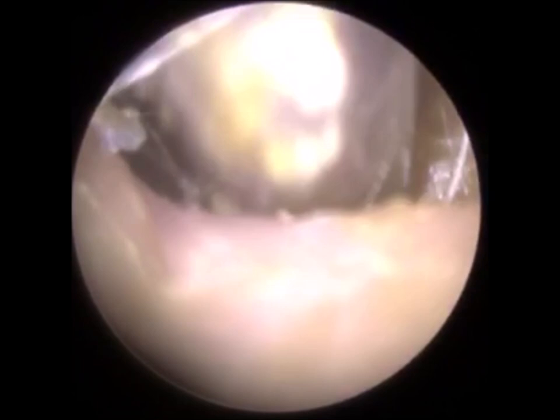If you can see the dead skin on the posterior canal wall, the back part, it almost looks like wax. It's darker, but that's not wax. That's oxidized, which means that piece of skin, that keratin, just to the left where the suction probe is, has been in that ear for a long, long time. The other shades of dead skin, the lighter brown, the white, it's all fresher skin. Now, when I say fresh, it doesn't mean it's just been secreted in the last few days or weeks. It still could be in there for years, but that's what I'm making reference to. That darker piece of dead skin has been there for a lot longer than this lighter shade.